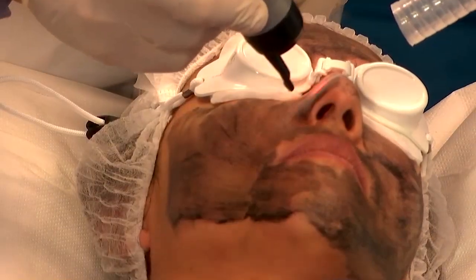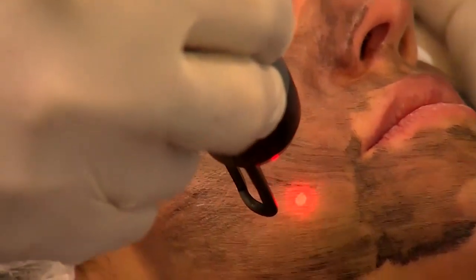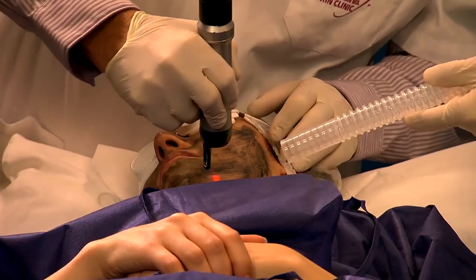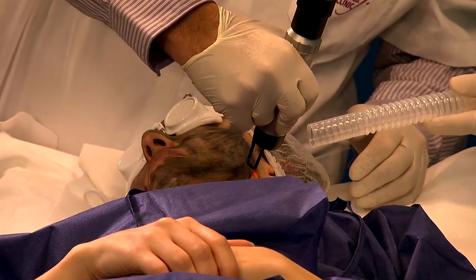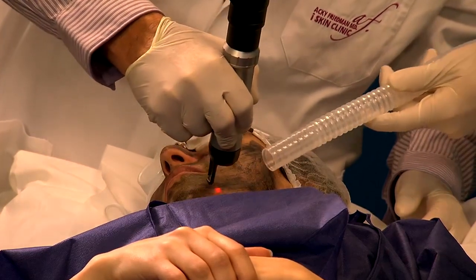You can work with this laser from a little far away because it's a collimated handpiece — an eight-millimeter collimated handpiece — and so the energy that comes out is equal to the one that goes in. We want it to be dried out as much as possible just so the procedure goes well.